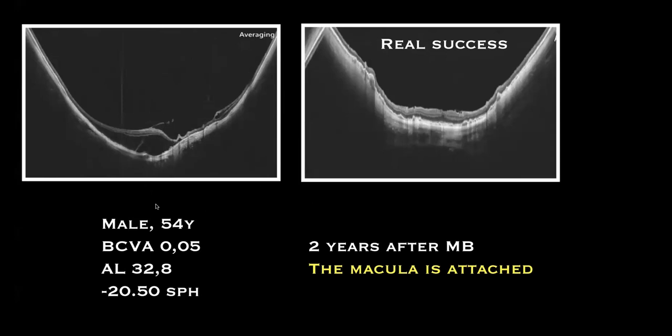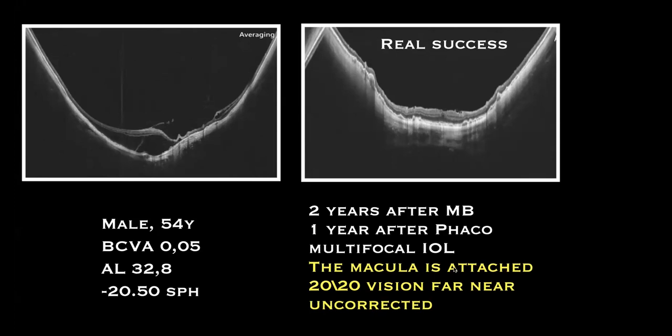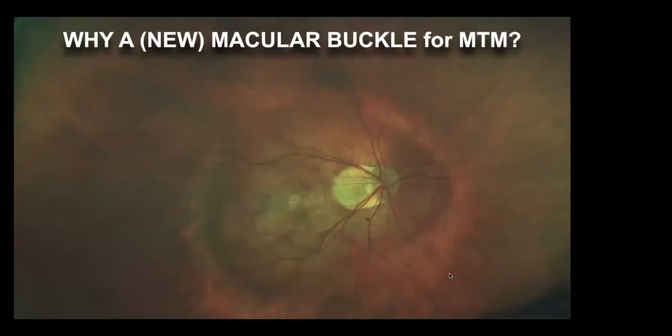He originally had a macular detachment in stage 3AO, axial length 32.8 with 20.5 diopters of myopia. You can see on the right the result after macular buckle. I also removed the cataract and implanted the multifocal IOL. He can see 20/20 far and near uncorrected. So this is what I define as real success in MTM surgery.